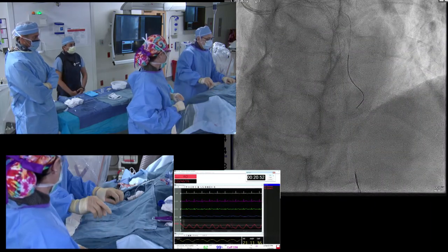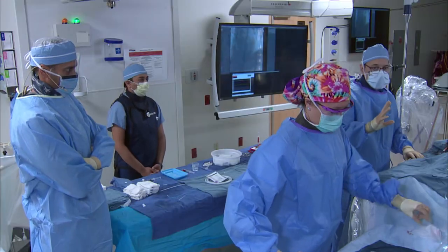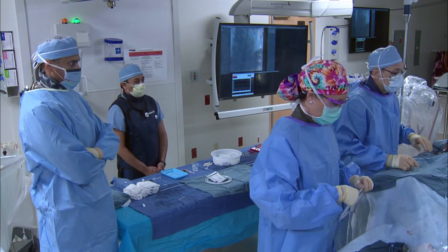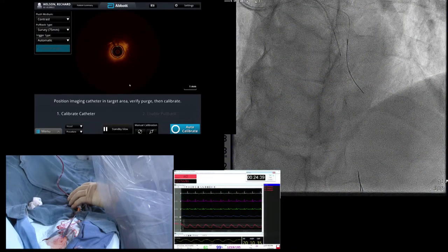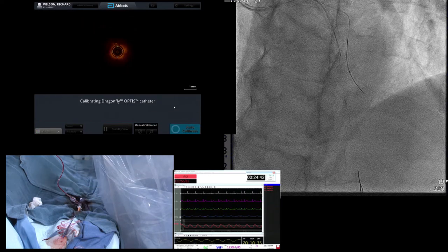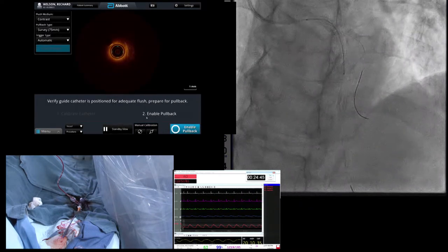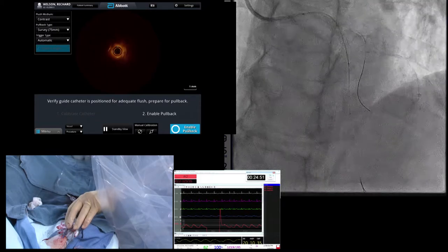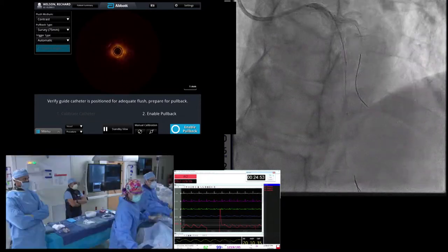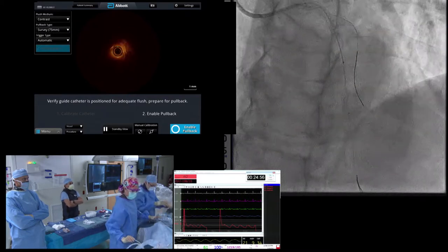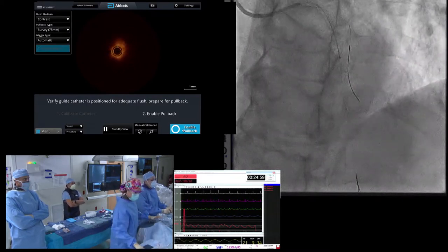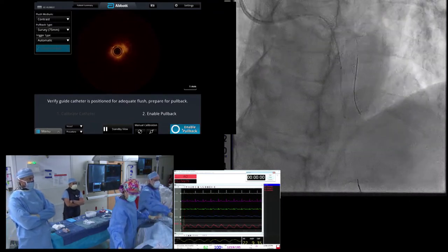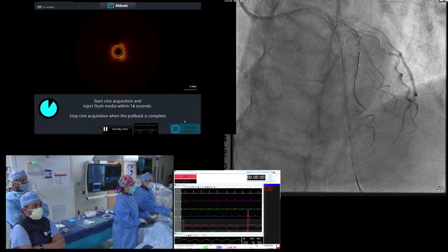Now the next thing to do is set up the OCT and image this thing. We have our OCT catheter in place. Tracy is going to stabilize it and make sure we don't pull it back. I'll clear my catheter. Bimal, I think that's good position — and I want to pay attention to that very proximal LAD when we do this run.